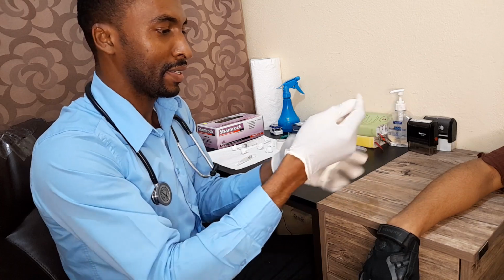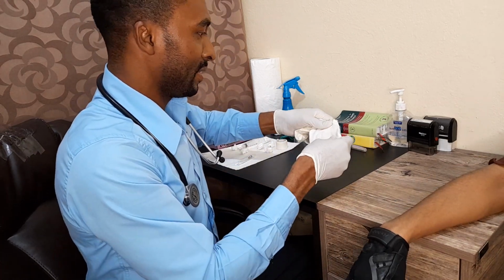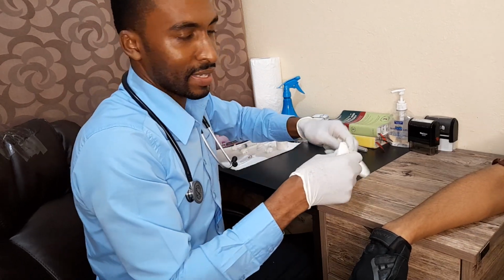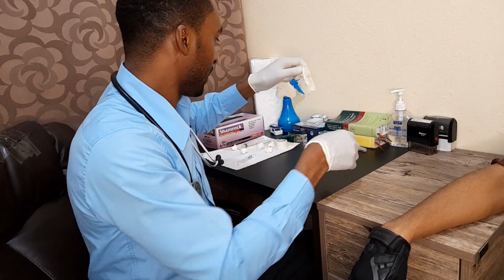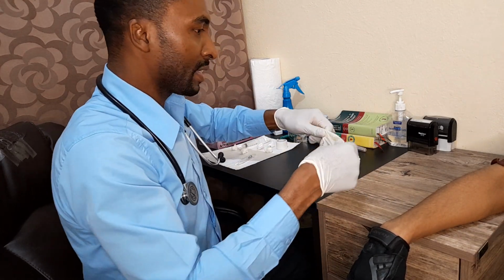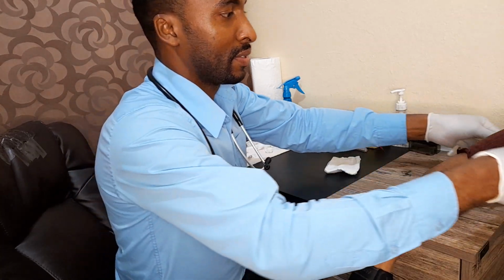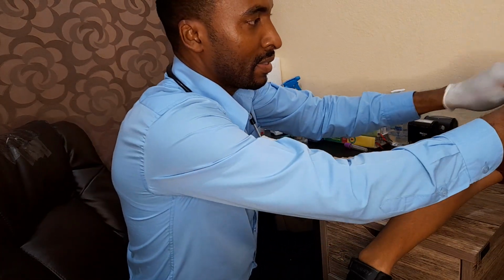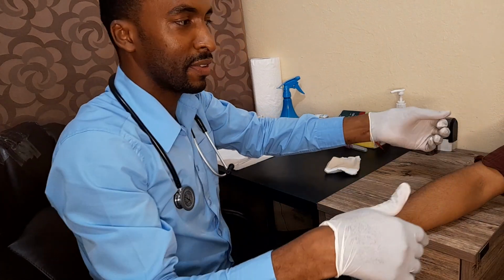Alright? So as we know, blood taking is not a sterile procedure. We normally don't have to use excessive betadine. We only need to clean the area with alcohol, and then take the blood. So normally we should have an official tourniquet to tie on the patient's arm, or it could even be the forearm.